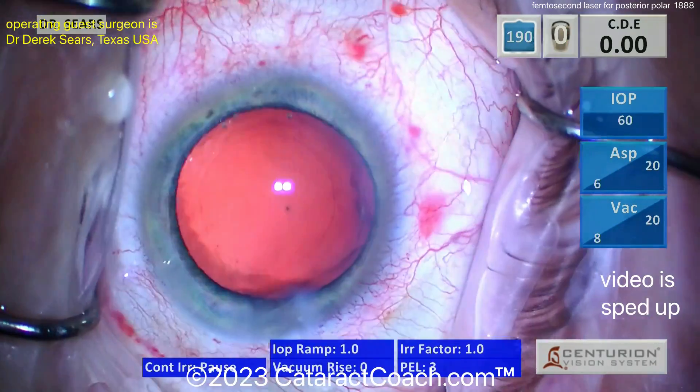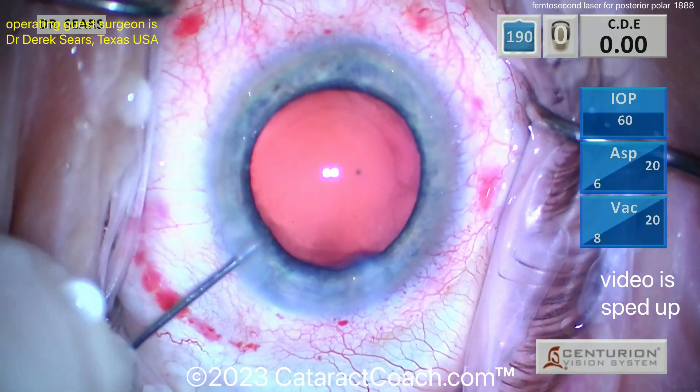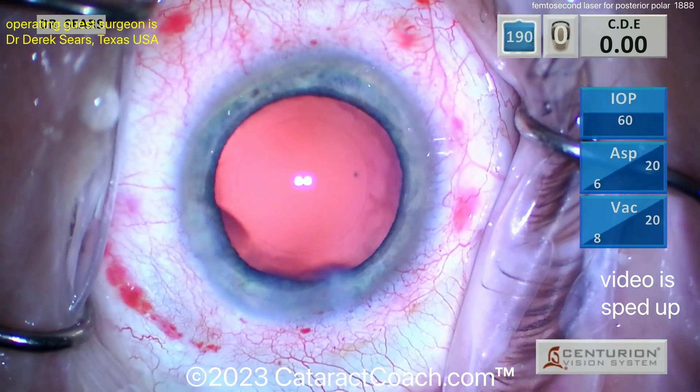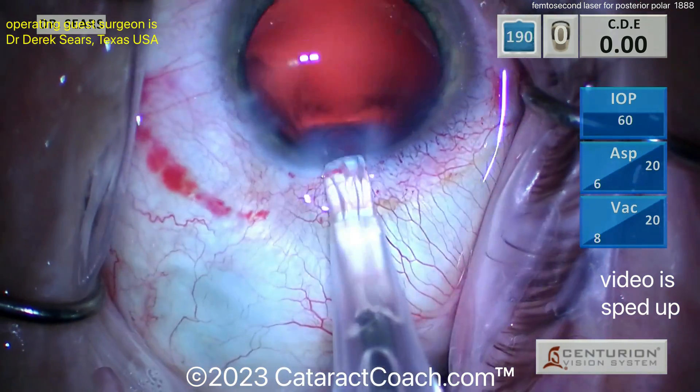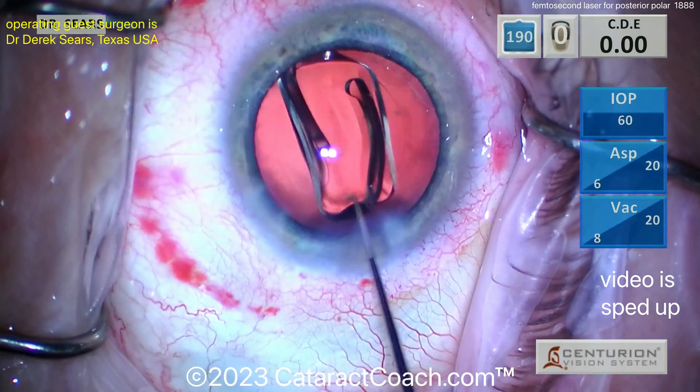Came out without the viscoelastic first — very good, because you were fast and didn't let the AC collapse. Wow, I would have put the viscoelastic first, but there are so many ways of doing a successful surgery, and this looks like a fantastic job.